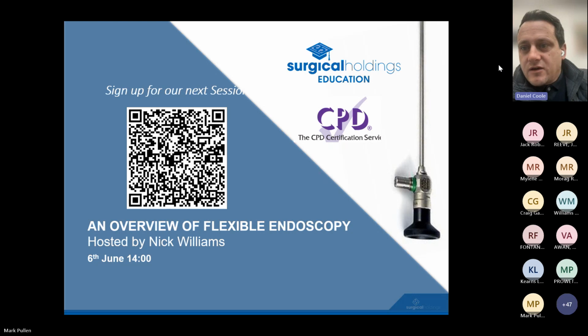Dawn has said, are theatre staff educated on the correct use of light cables versus scopes being used? Well, it's difficult to say, and that's why we tend to try to reiterate it in these sorts of sessions, because I suppose the theatre staff are going to probably grab whatever cable is on the tray, and maybe may not realise if a cable is a higher diameter, if the tray is set up and it has the wrong one. So I think it's about sharing that information really, and just being aware of how important that is.